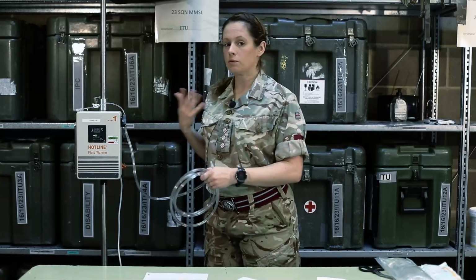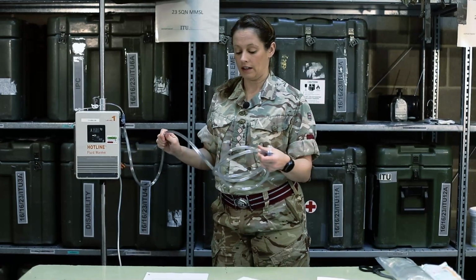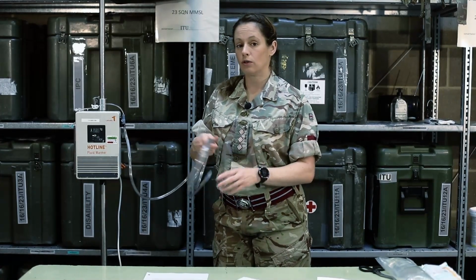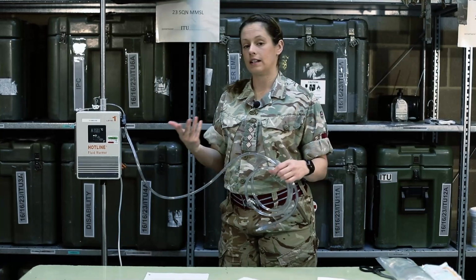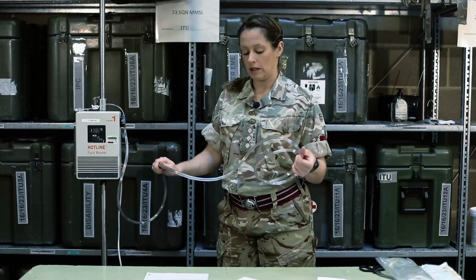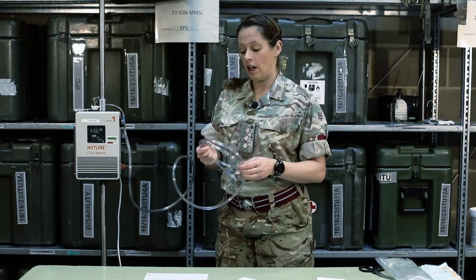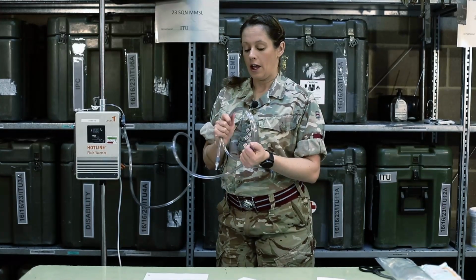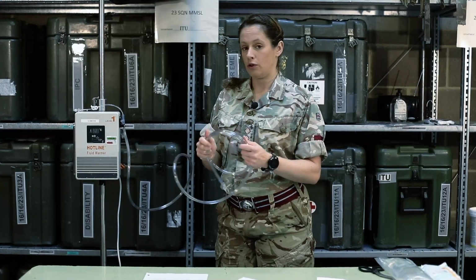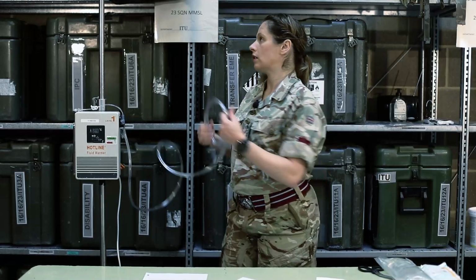And as you can hear, the audible alarm's gone off and you can see and hear it circulating in the giving set. This will get rid of all of the air, and the fluid encapsulates the giving set and will deliver warm fluid at 41 degrees. It'll take 4 minutes for the fluid to get to temperature and I can already feel it in my hand. But yeah, give it 4 minutes and wait until the temperature on the gauge has got to 41 degrees.